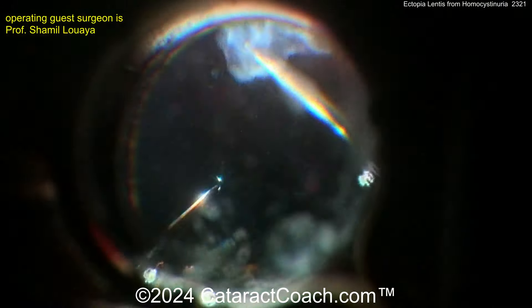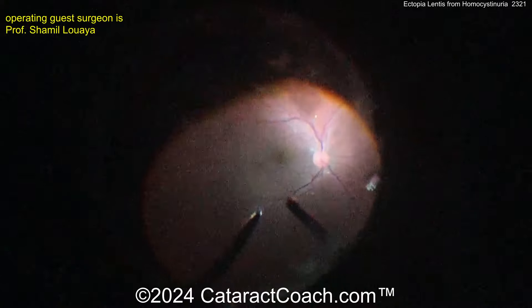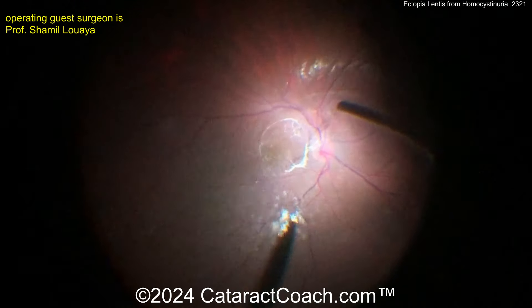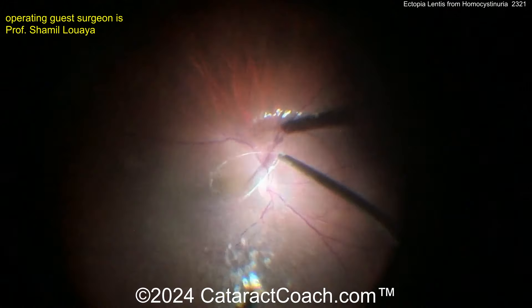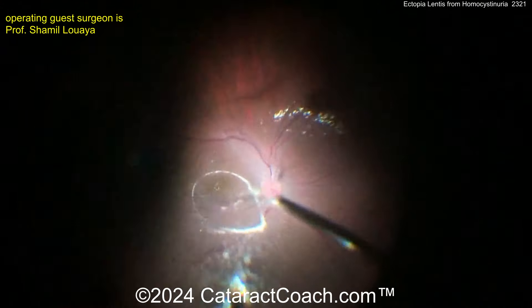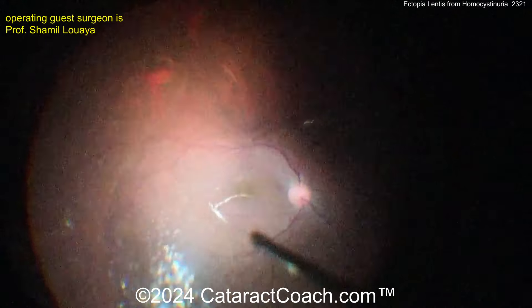Looking back at the posterior viewing system — that looks great. Get all that lens material out of the eye. A vitrectomy can be done here, but be careful with these patients because they are young — this patient is 21 years old. Getting all that vitreous out of the eye may create a PVD in this younger person.